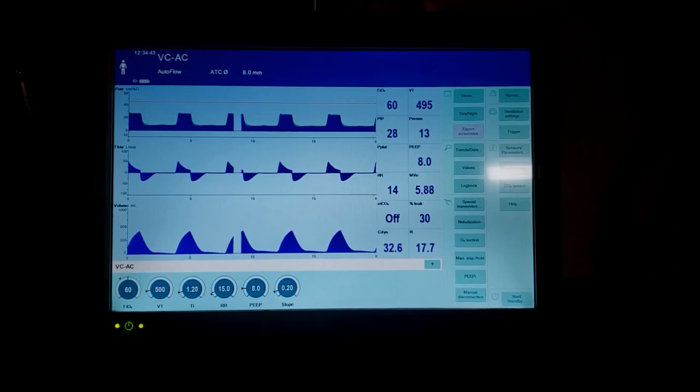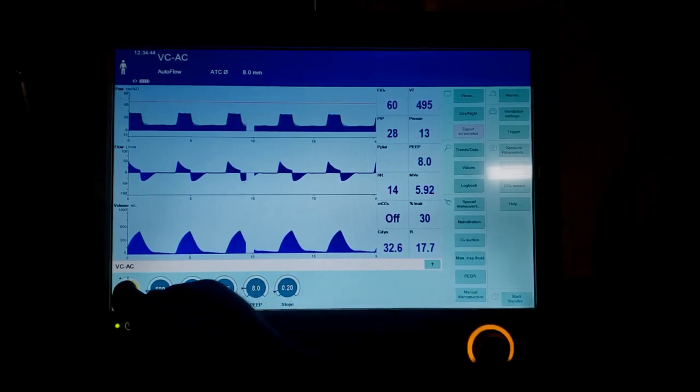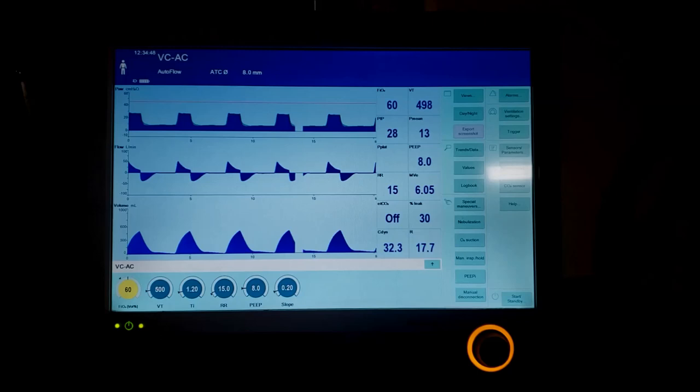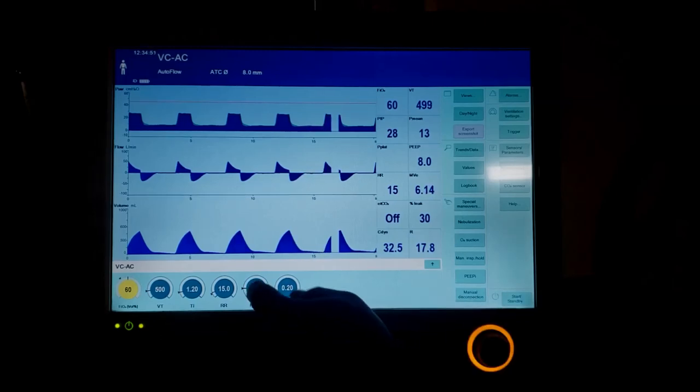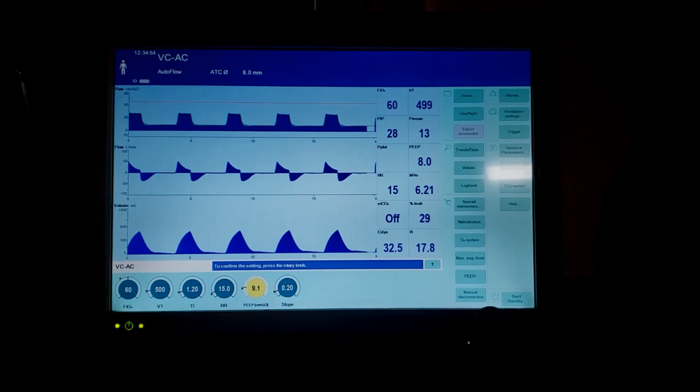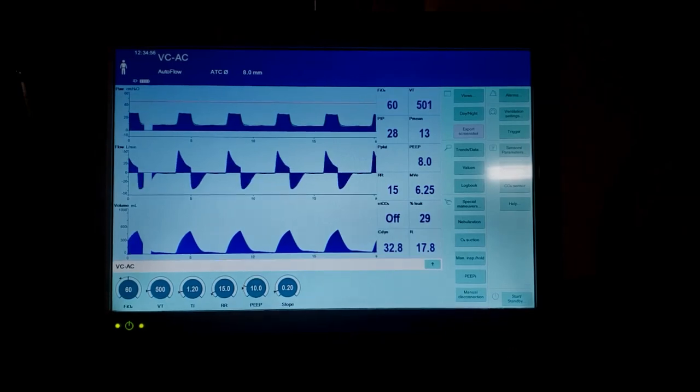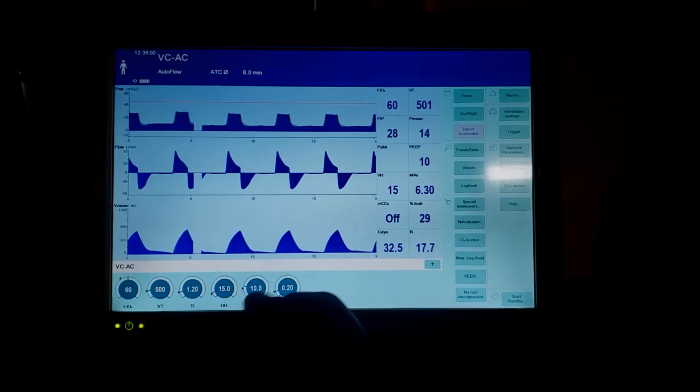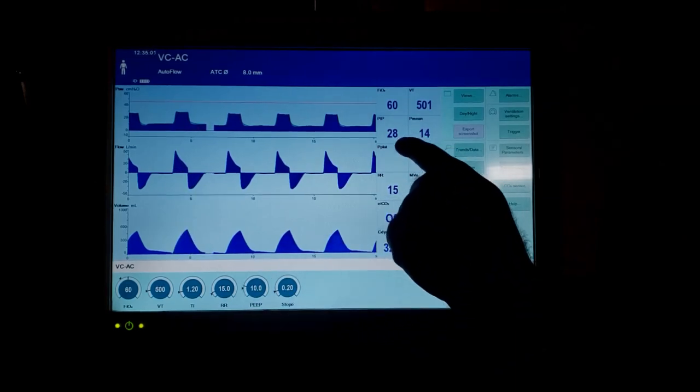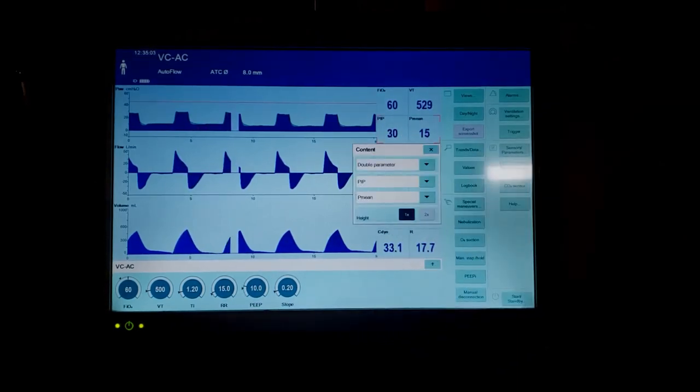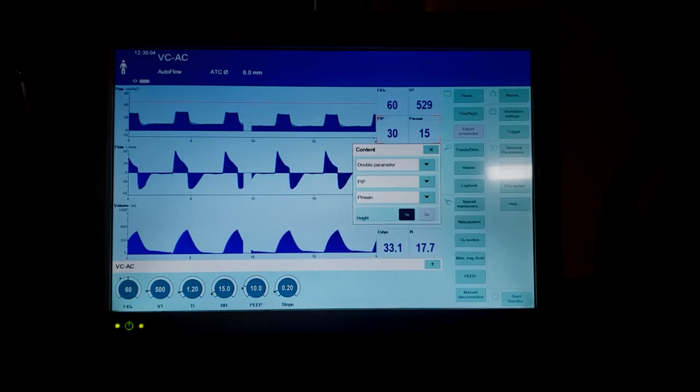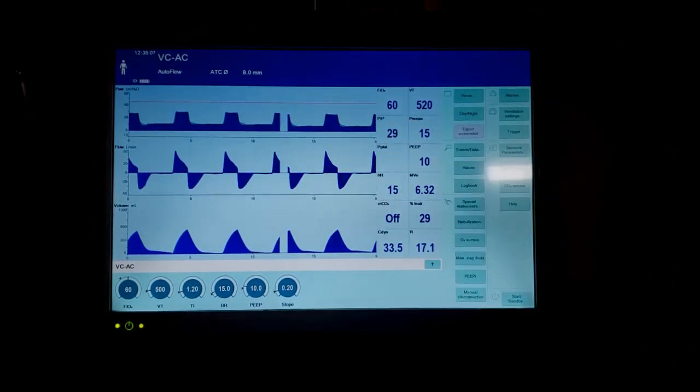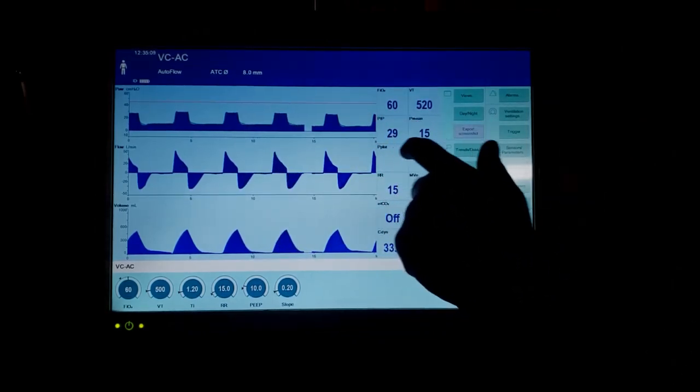For oxygenation, we go up on FiO2 usually to about 60, and then we start manipulating the physiological causes for refractory hypoxemia, which is going to be some issue with their PEEP. We can increase their PEEP. People are afraid of increasing PEEP - I wouldn't be. This isn't the important number, this number right here is, because that's the total pressure inside their lungs. We like to monitor that total pressure inside their lungs, and specifically with ARDS, I'll do an inspiratory hold here. I'll show you - hold.